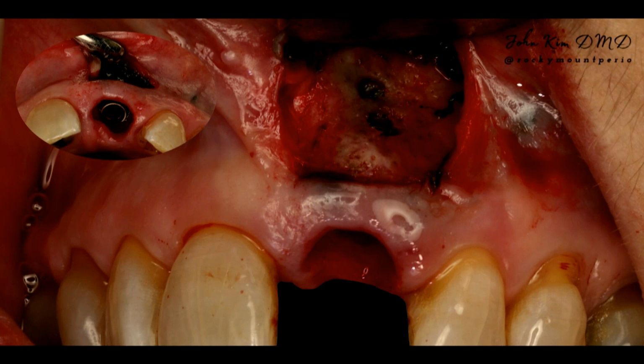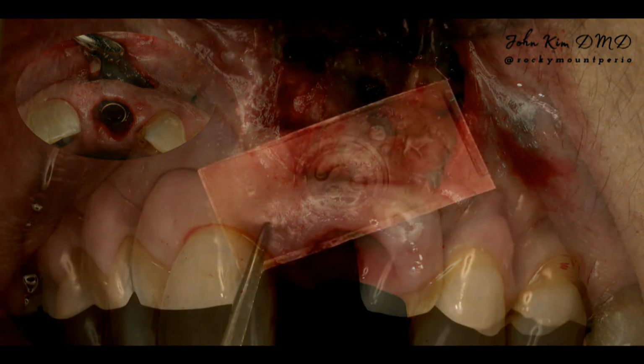And not wanting to disturb the marginal tissue, I went with more of a semi-lunar approach and raised the flap here and removed as much of that material as I could. And you could see just two very small fenestration defects here with a few implant threads exposed and more of a thin buccal plate.